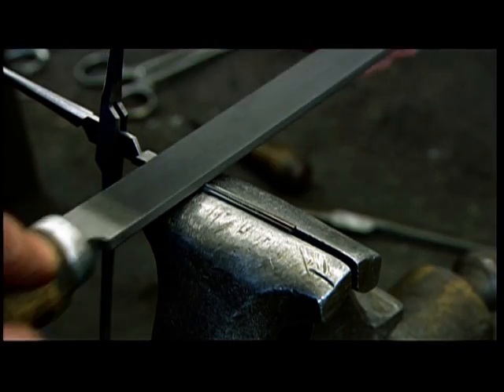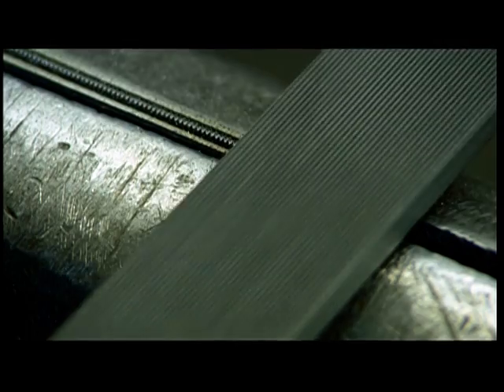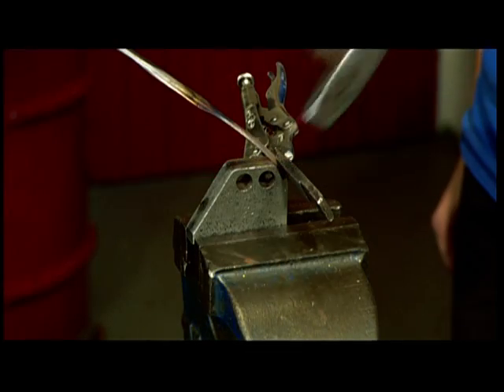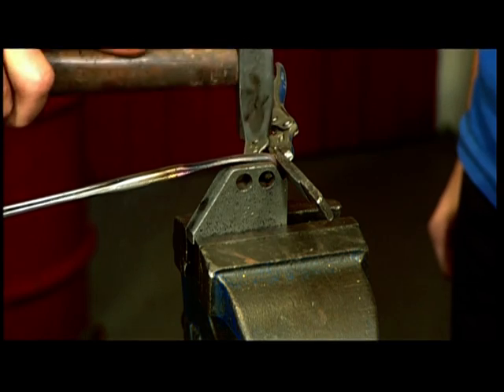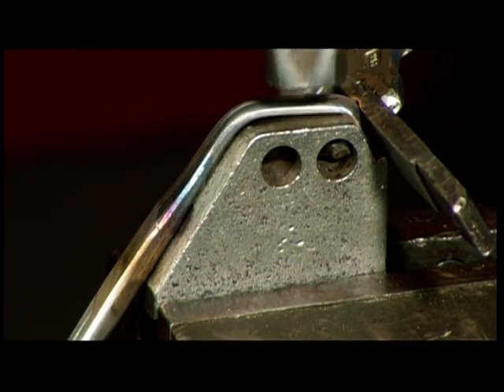Next, he files the teeth of the clamp so they'll interlock when the tool is closed. He bends the two ends around a tool to form the jaws of the clamp. These curved jaws will come in handy when the surgeon needs to reach around organs or bone.